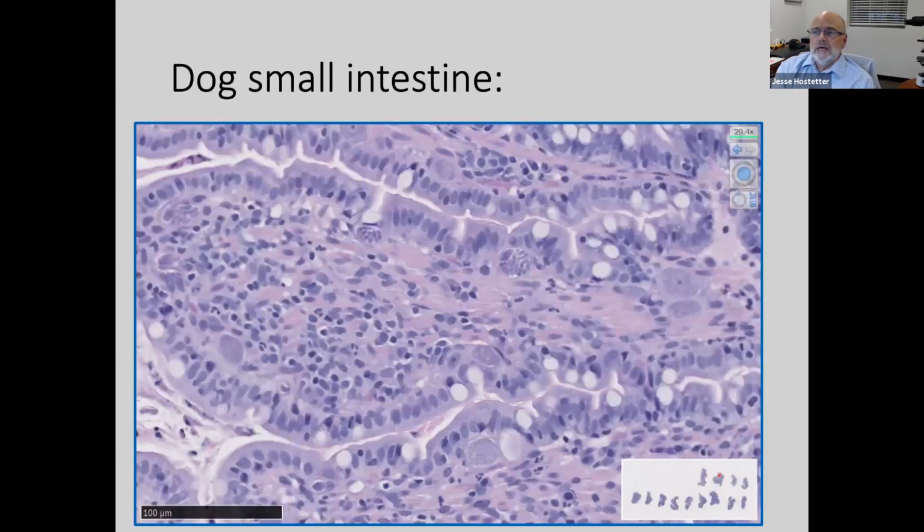This is the only time I've seen this. This was a dog with, we used to call this Isospora, which is now Cystoisospora canis. This was a puppy with chronic diarrhea and got an endoscopic biopsy. Normally they probably wouldn't do an endoscopic biopsy, they'd worm it, but it had probably been through several rounds of worming. But you can see the different life stages of the protozoa in the lamina propria, and I bring that along just because I thought it was kind of neat.